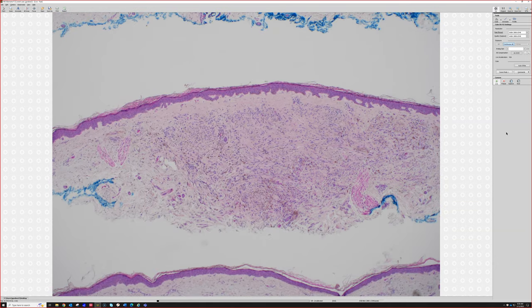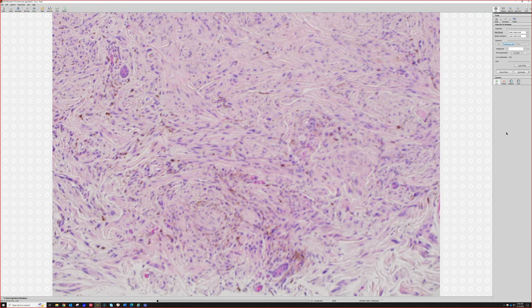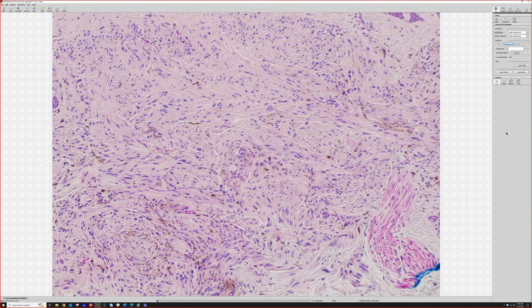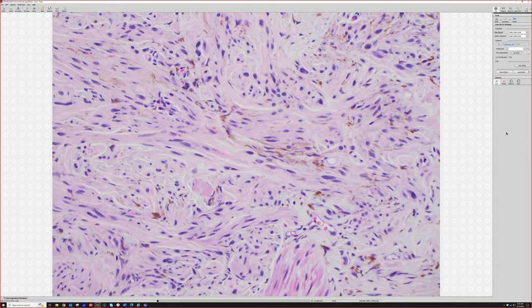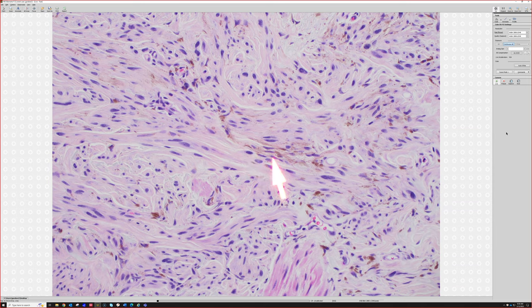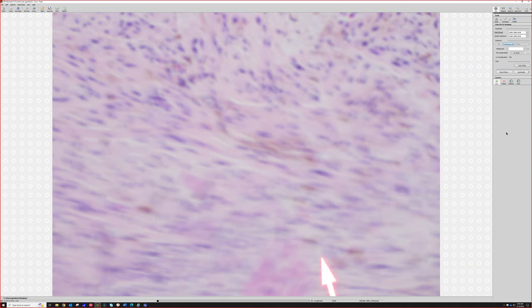Usually these lesions lack overlying epidermal change. So we go closer and we see that there are spindle cells that are kind of in fascicles with dense collagen in the background. The collagen in the background of a blue nevus is almost always denser than the background dermis. There is melanin pigment, which is usually fine, powdery, speckled pigment, some of which is in the spindled melanocytes, and some of which is more blobby and chunky and is within background melanophages.